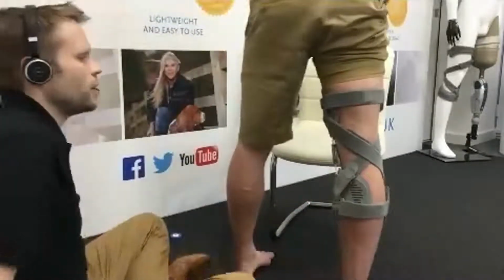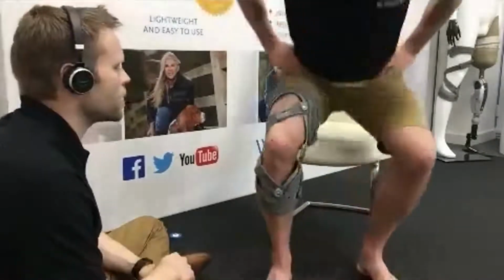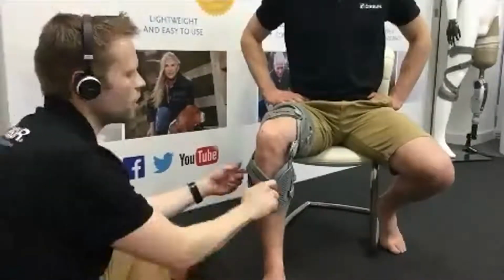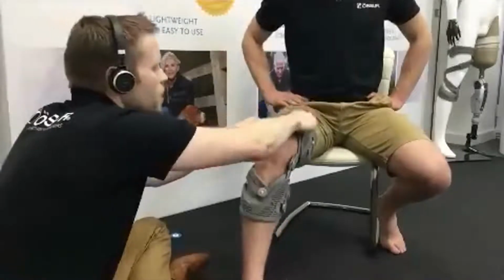Now, what we need to do next is just tension it back up. So Pete, take a seat again. We'll flex the knee, and we can use these smart dosing sections in order to adjust it. So in most individuals, we'd have it at 5. So I'm just going to tighten that to 5.